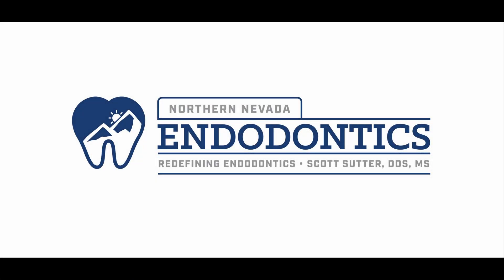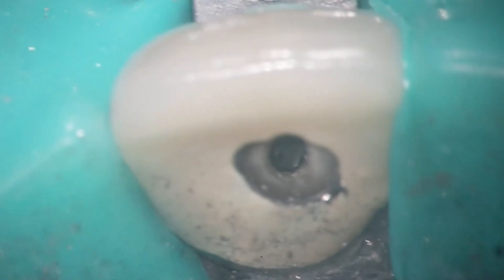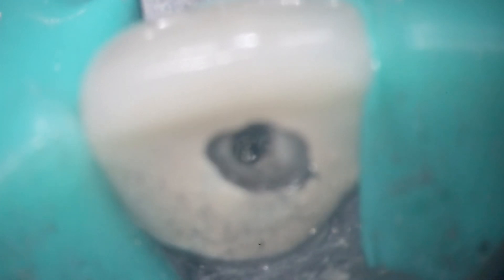Hello everyone and welcome back. Got a viewer suggested one here — shout out to Graham for suggesting this. The question is: how do we get pulp stones out of a canal? Thankfully I don't have to deal with this too often, but I had a perfect one. As you can see, that pulp stone is stuck inside there, and my paper points are coming out bent.